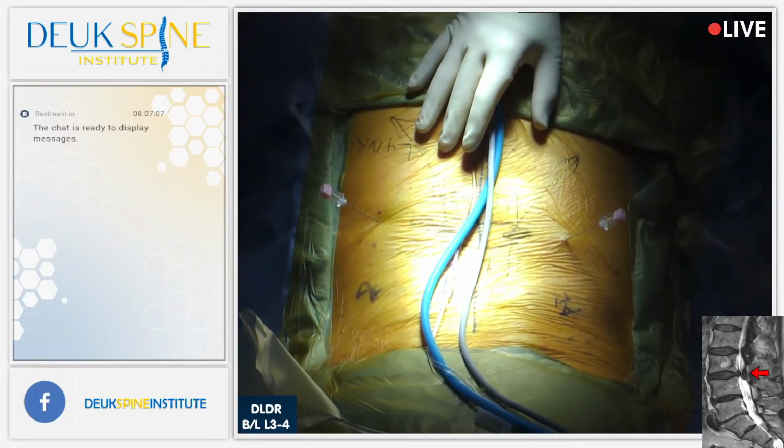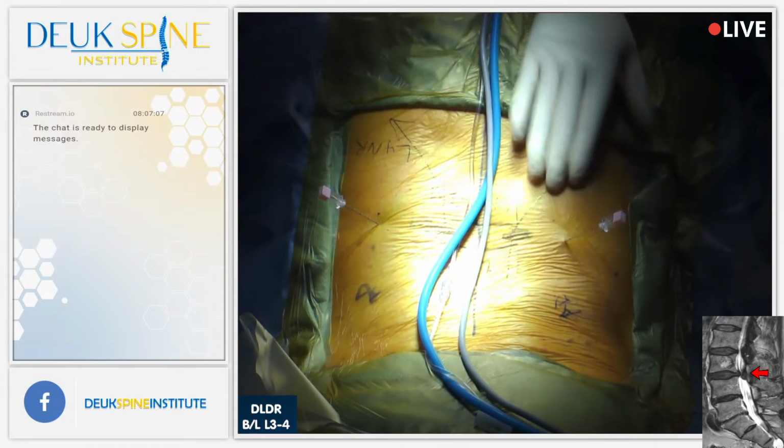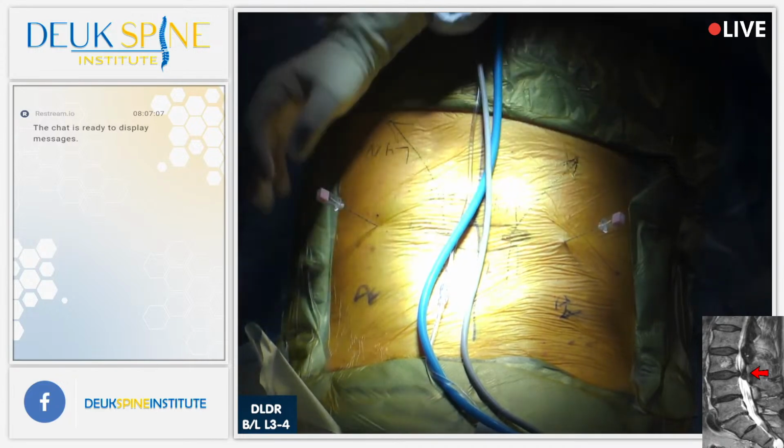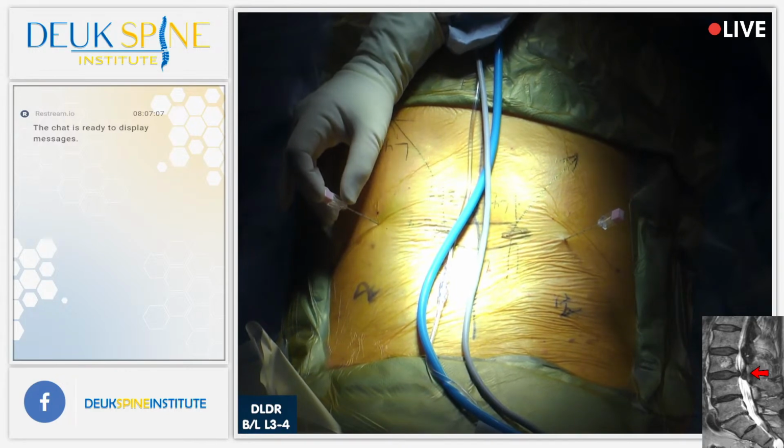Open your eyes. Yeah, perfect. Can you open your eyes? Good. Okay, Dr. Duke has some questions. I need you to lay still, okay? He's opening his eyes now. Can you lay still for me? I'm going to place the first needle. Are you okay?